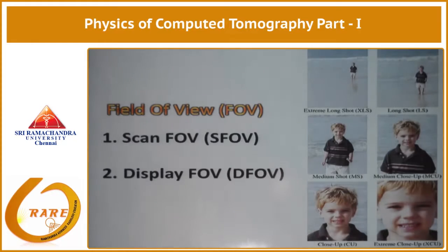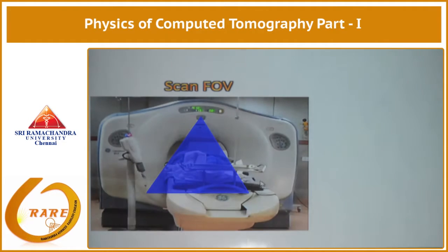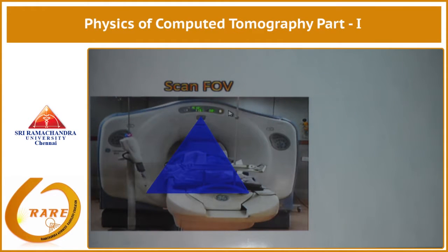Actually, there are two fields of view. One is scan field of view, another is display field of view. First, let us see about scan field of view.